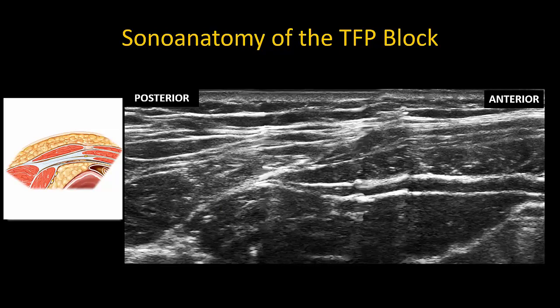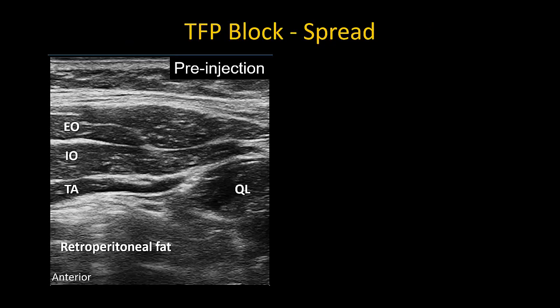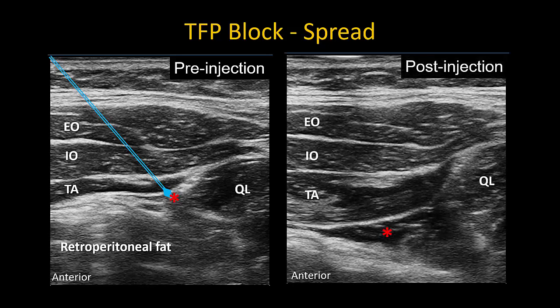This composite sonogram illustrates the sonoanatomy of the region. Starting anteriorly, the three layers of the abdominal wall can be readily identified. Internal oblique is usually the thickest layer, while transversus abdominis is thinnest and darkest. More posteriorly, transversus abdominis and internal oblique taper off into their common aponeurosis, the thoracolumbar fascia, and abut against quadratus lumborum. The dark hypoechoic area deep to the tapering off of transversus abdominis is retroperitoneal fat. The asterisk marks the target for needle tip placement, just deep to the fascia of transversus abdominis. Injection here produces a visible pocket of local anesthetic that pushes the retroperitoneal fat downwards. Injection above the fascia distends the transversus abdominis muscle, which is a sign that the needle needs to be advanced one fascial pop deeper.